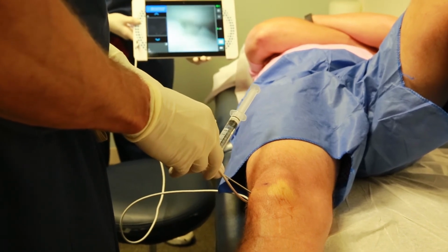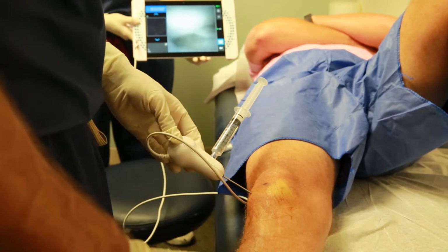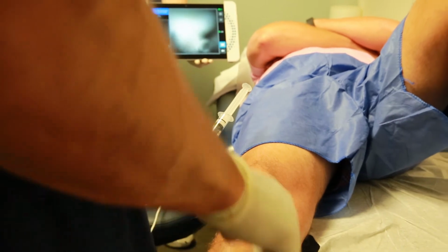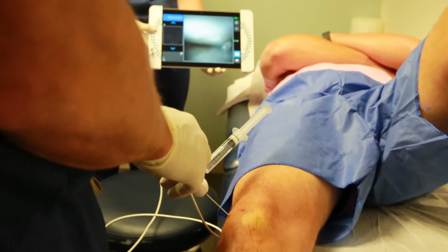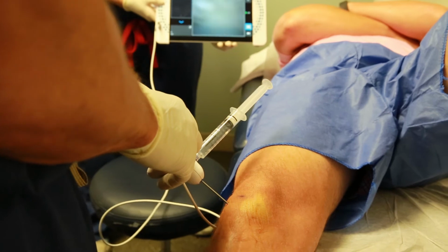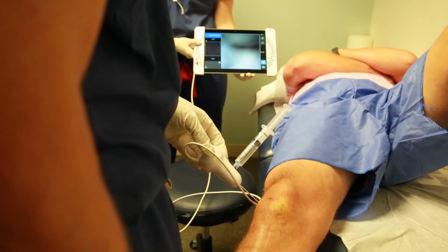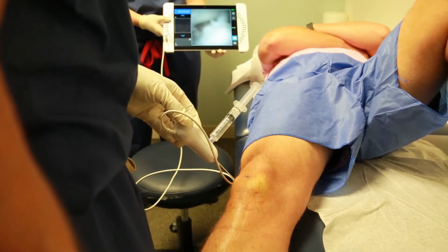Put a little bit of fluid in the knee, and catching the notch often is helpful. If I take his knee and cut it down about 30 degrees, then I can get his medial compartment pretty nicely. Jason, how you feeling? No, fine. You're not having any pain? No. If your assistant sometimes puts a little bit of force on, it could be helpful.